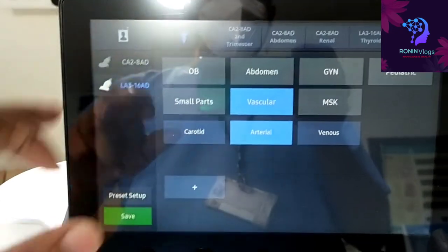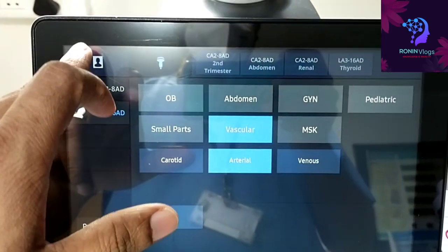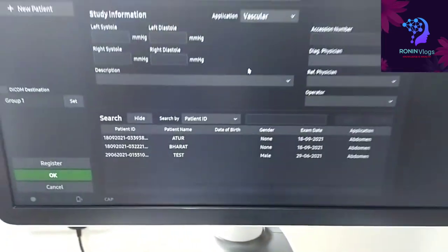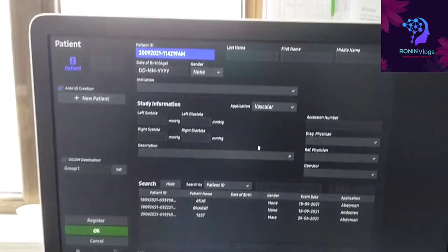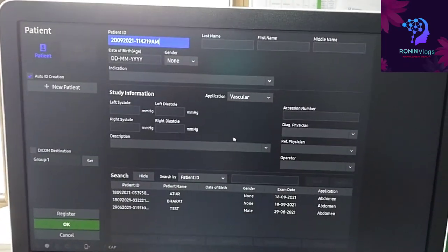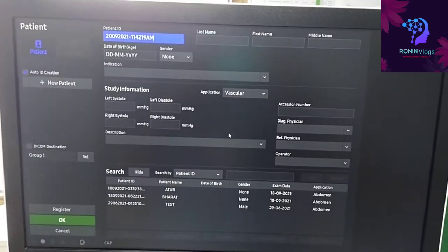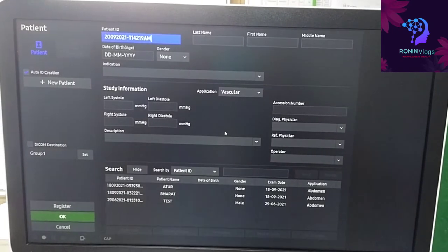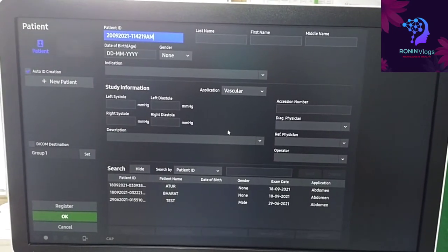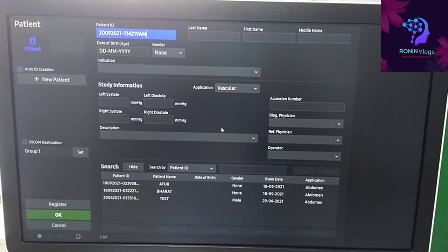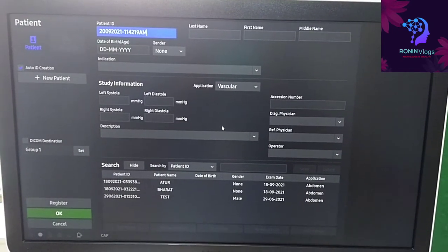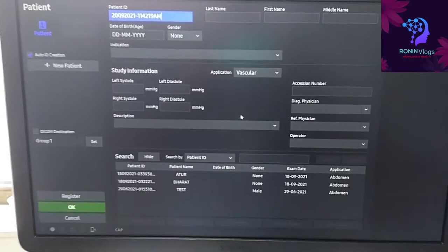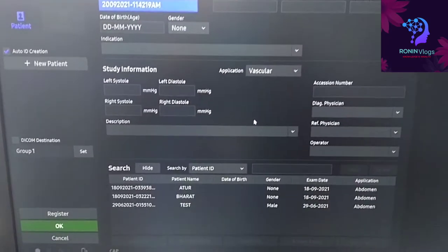After that, press the save option if we need to add the patient details. Press the upside button, then we need to add the patient details. After that, open it and it will save the details of the patient.